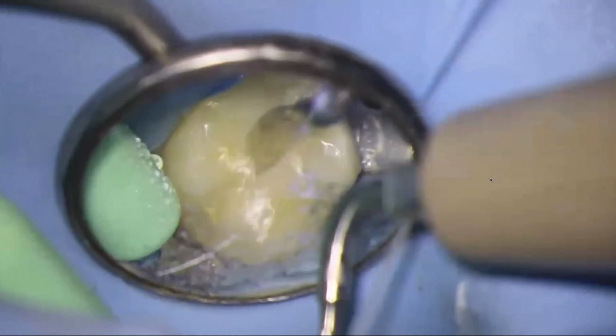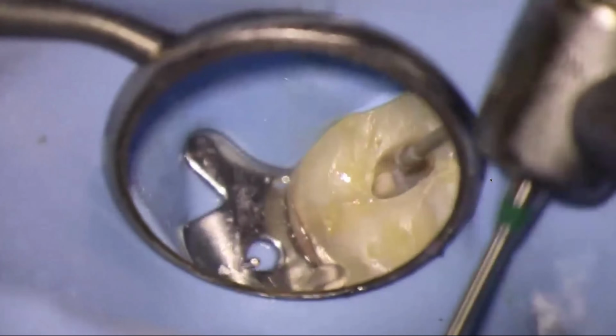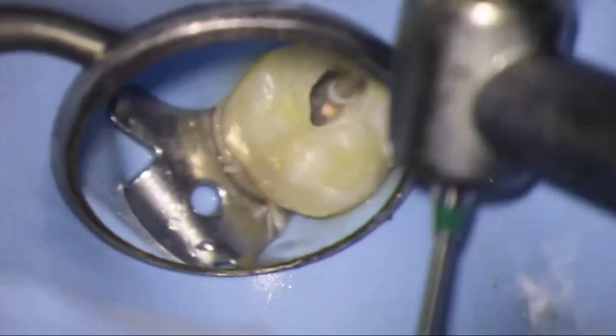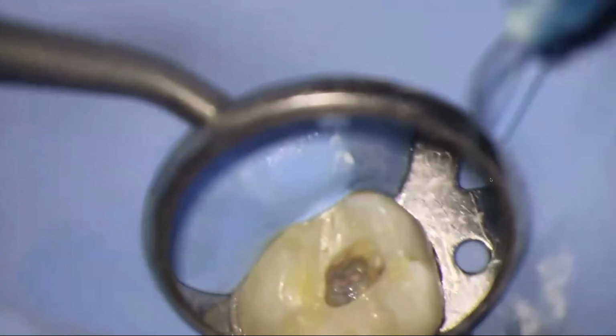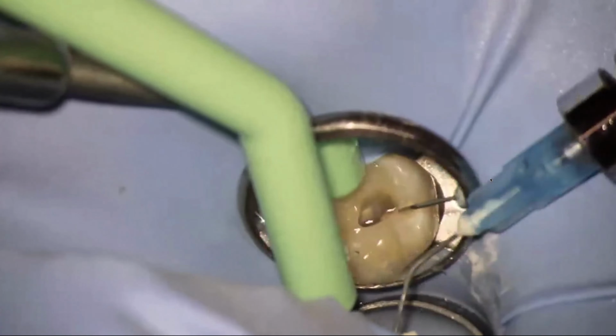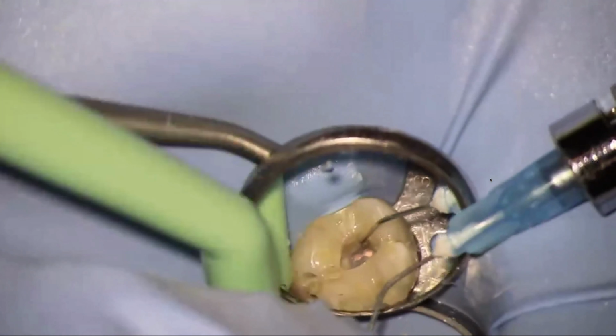Again, I'm cleaning with an ultrasonic with water, which gets rid of the sealer really effectively, and then the same principles. Okay, dentin shaving, just minimal shaving, just to clean up and freshen up that dentin and expose the collagen a little bit more. Rinse, and then the same thing. Etch, leave your etch for the appropriate period of time. Rinse for a minute, get that dentin hydrated. And then we carry on with the bond.